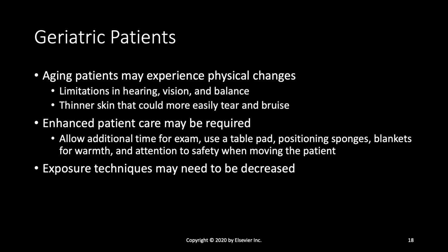For geriatric patients, these patients may experience physical changes such as limitations in hearing, vision, and balance. Also, their skin is thinner and more easily torn or bruised. So be careful when you are transferring them from wheelchair to x-ray table or from bed to x-ray table because of their thinner skin.